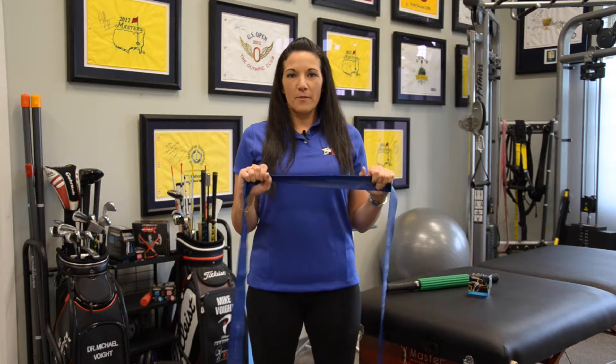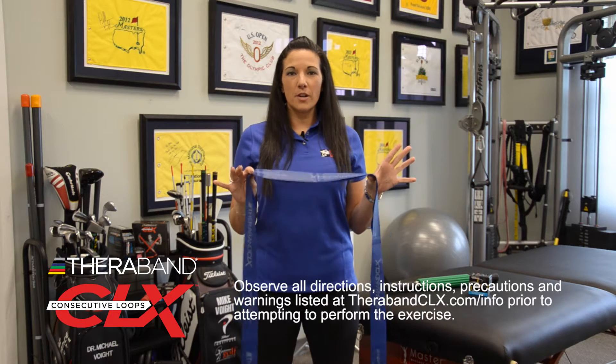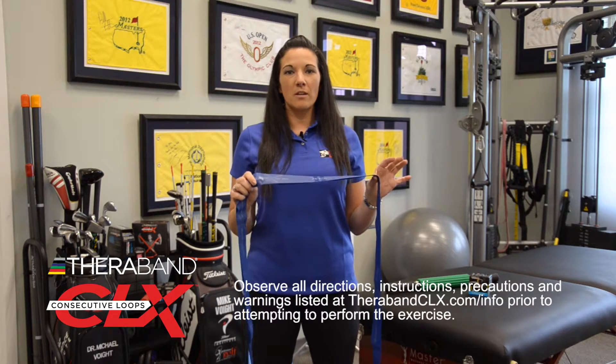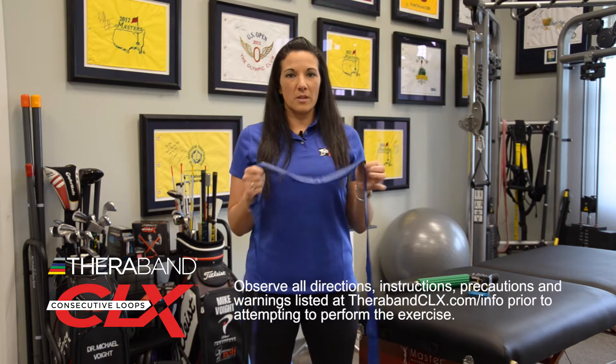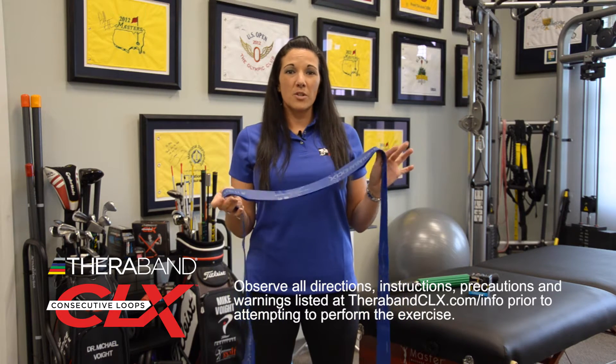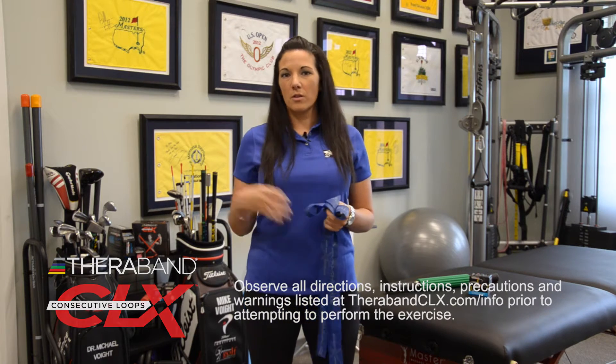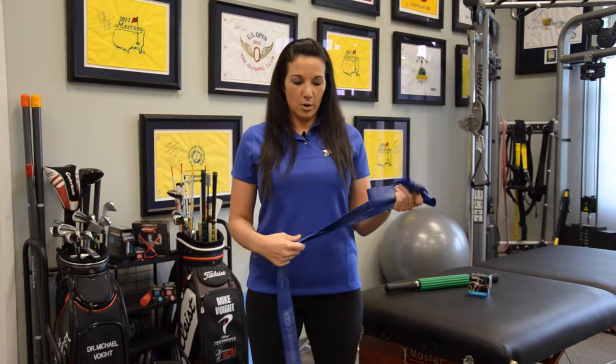I saved my favorite for last. I want to talk about the TheraBand CLX band. First and foremost, it comes in individually packaged bands so you can get something that your patient can buy from you at the clinic, take home, and perform their exercises with. You can also get it in a bulk roll, so it's perfect to just have for use in your clinic or your performance center.